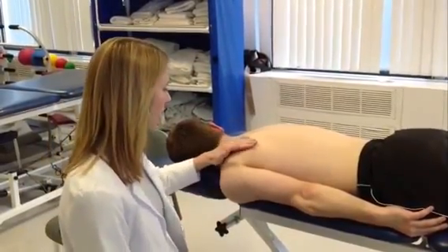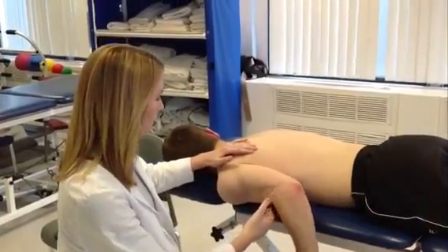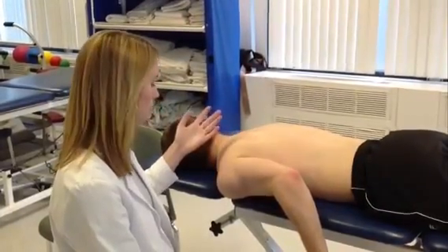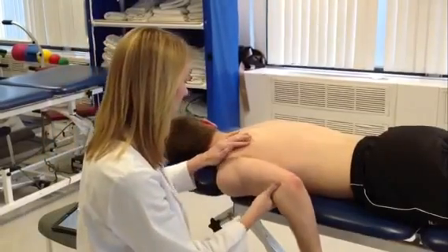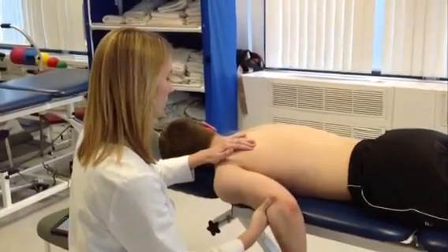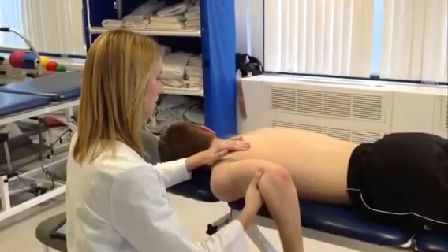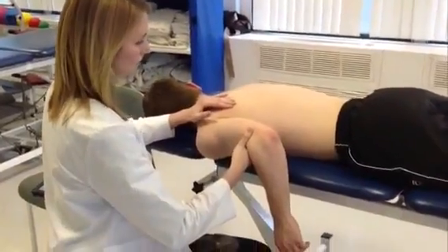So if you can go ahead and take your arm off the table and just do the motion we've been doing before and stop right there. So that's the end motion of your glenohumeral extension. So this time I'm going to do it for you. So if you can just relax your arm, and I'll show you the motion I want for this movement. It's like right there I feel the inferior angle start to pop up.